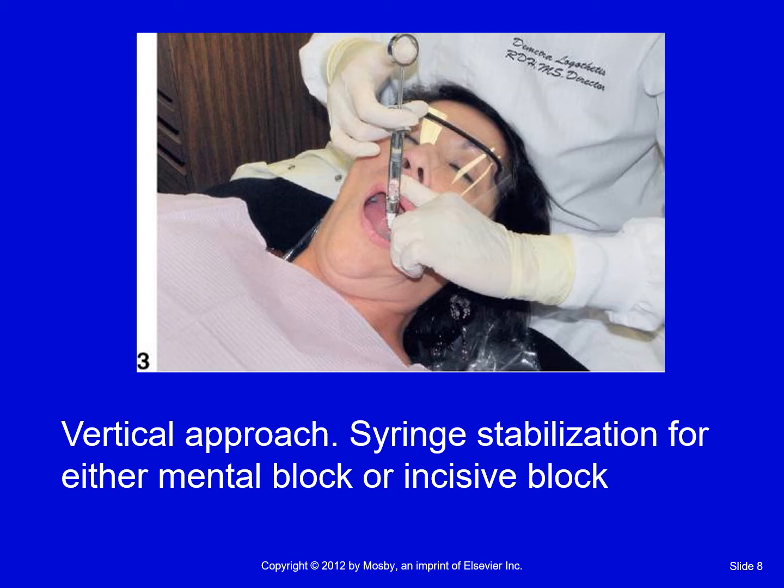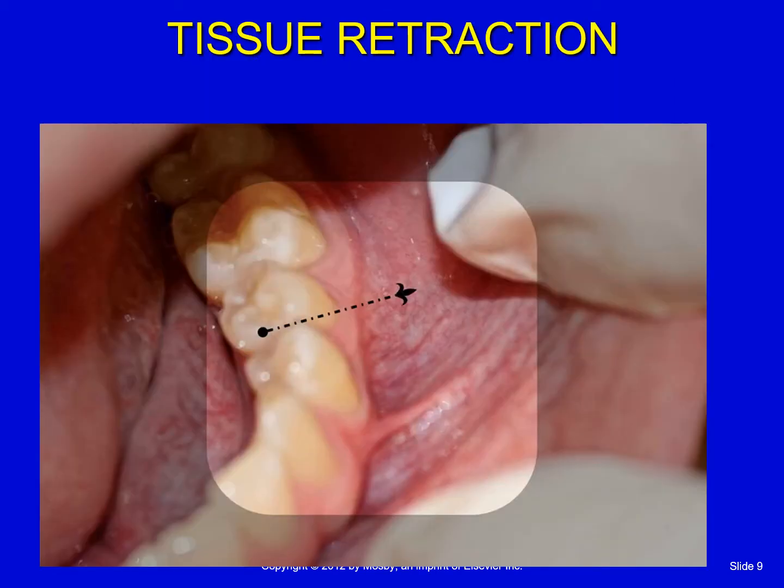And I added this picture in here again to show you the difference of how you can put your index finger up on your non-dominant hand and kind of steady the syringe barrel. So when you're fulcruming, you're going to pull the tissues and make that tissue really taut, and you can see how far away that you are going to be injecting, kind of at the top of that fleur-de-lis or whatever that is. The point of it is probably where you'd want to penetrate that tissue.